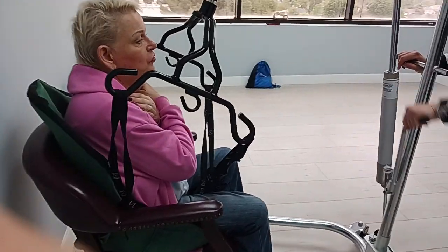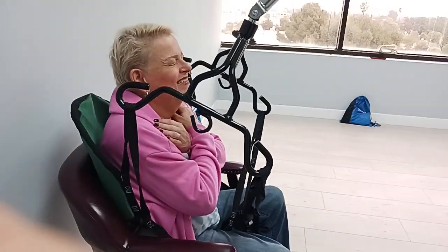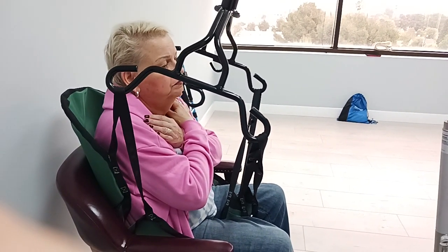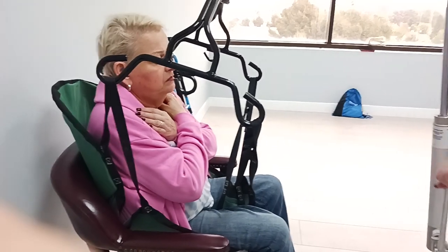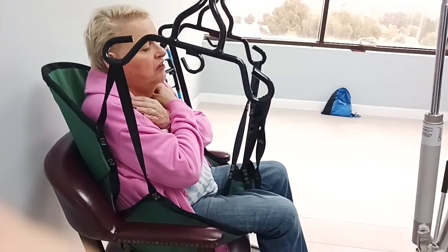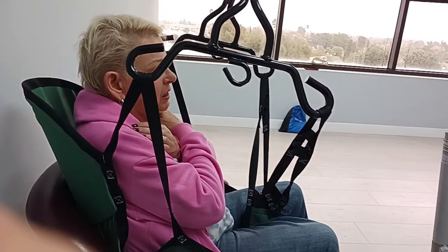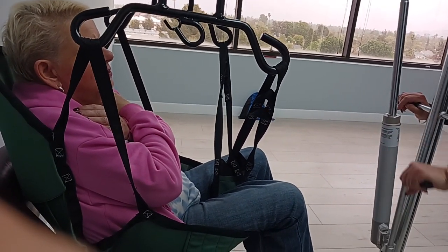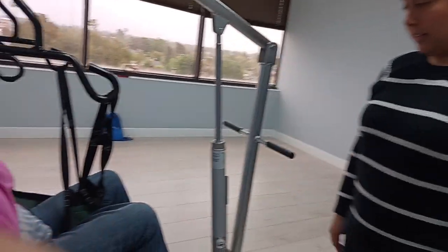It's lifting now — chug, chug, chug. That thing's pretty strong. It'll lift a 300-pound person. Oh, wow. That's what it's good for. We have a couple of patients right now who use it.